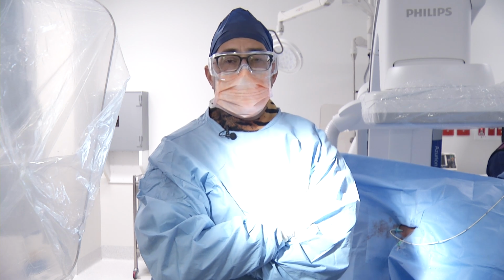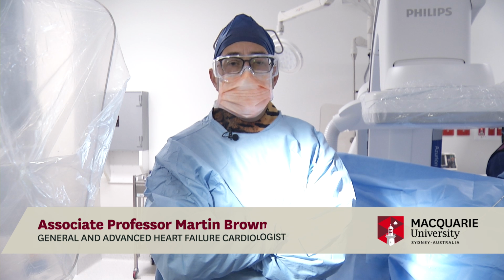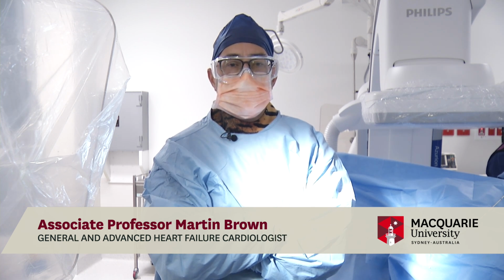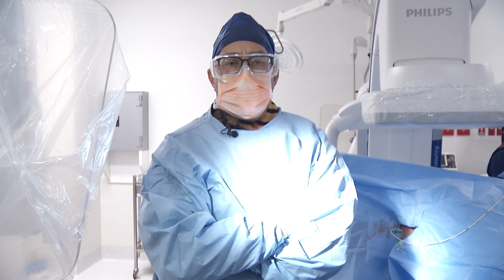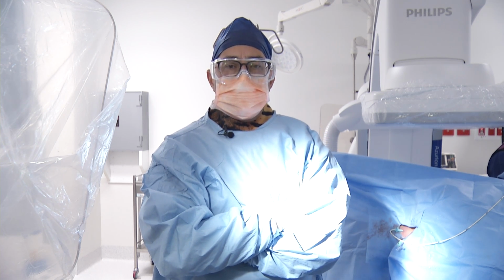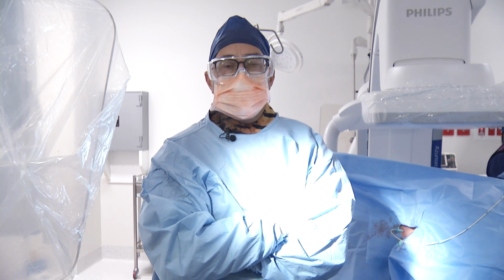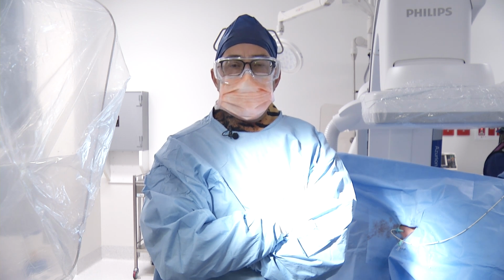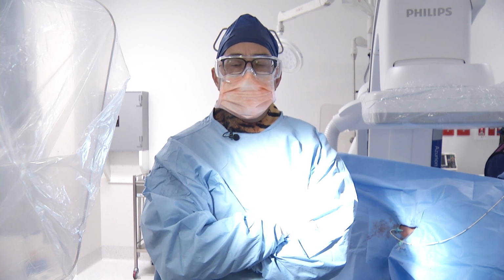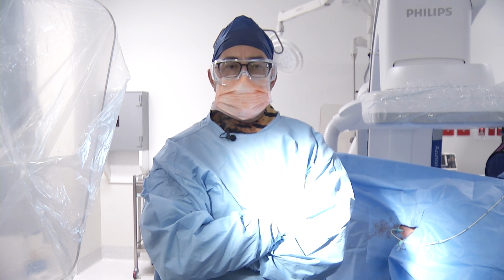So now we're going to demonstrate a vasodilator challenge. This is performed in patients with group 1 PAH, especially idiopathic, familial or drug-induced. The idea behind it is that those patients who are vasoreactive, i.e. their mean pulmonary artery pressure falls below 40 millimeters of mercury with a drop of 10 millimeters of mercury, are considered responsive, and will have a better long-term outcome with the use of calcium antagonists.